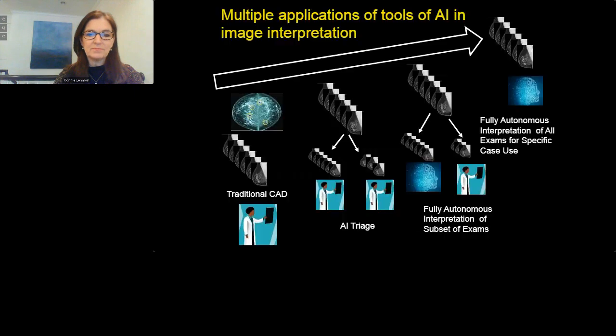Now, if John Wolfe were to visit me at Mass General and come into our imaging clinic, he would recognize the mammograms. He would recognize how we're viewing them. He'd understand that we were looking at batches of screening exams from our patients. He would absolutely be impressed by the incredible advancements we've had in the technology to acquire better images, the digital technology, the advanced applications that we have in tomosynthesis. But he wouldn't notice significant differences in the paradigm for how we screen.